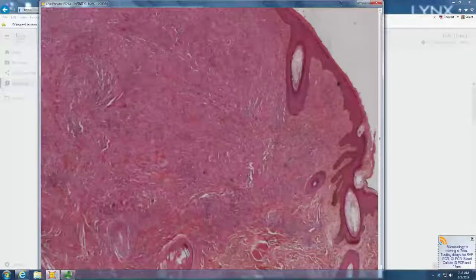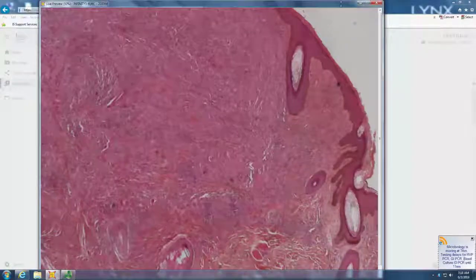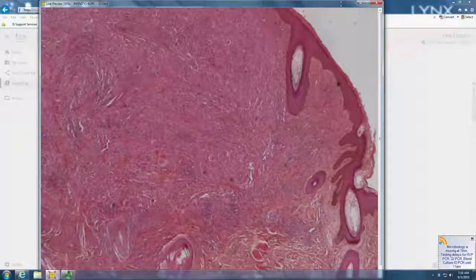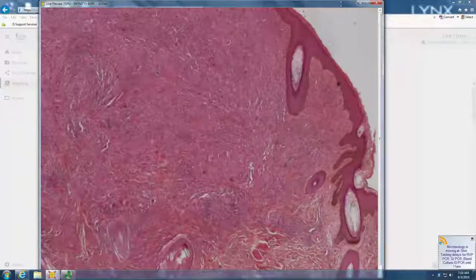Characterized in its early life by sheets of histiocytes. Then around the periphery of the lesion, the top, the sides, the bottom, you start to get wreath giant cells, and then they lipidize. That's the life of the lesion. Early, just sheets of histiocytes. Later, wreath giant cells starting around the periphery, then they lipidize and become Touton. And what do you call the cells when they're really large? Touton. Touton. Very good. Good. Could be on an exam.